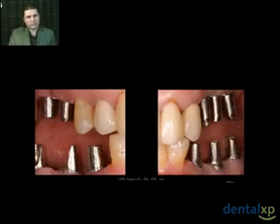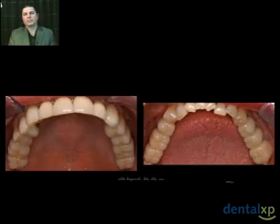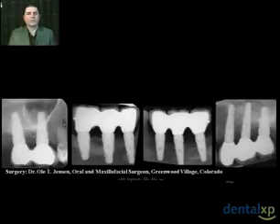Consequently, as a restorative doctor, I would like to take advantage of splinting these restorations for biomechanical reasons, to be able to distribute the stresses more evenly and give the patient some biomechanical advantage to the restoration. The restoration is going to be cemented on also. So the abutments are prepped, the restorations are adjusted, fitted, finished and cemented in place, providing the patient aesthetics and posterior support at the same time. These are the x-rays, indicating good contour, gradual emergence profile developed directly from the implant platform, utilizing these pre-contoured components.